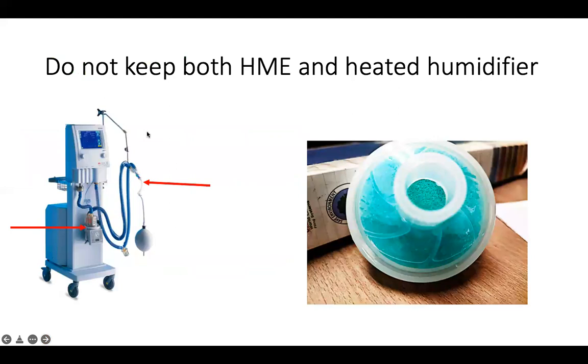And sometimes, because you're always emphasizing that humidification is mandatory, we come across situations where patients have been started on a heated humidifier, and on top of that, you have kept an HME filter at the patient end. Please do not do that. It is either HME or heated. You cannot combine the two, because what happens if you keep both? A heated humidifier will humidify the air-oxygen mixture, and you would have seen there's always some amount of raining happening there because it is highly humid, and the whole of this water is going to get entrapped in the HME and it will create far greater dead space.